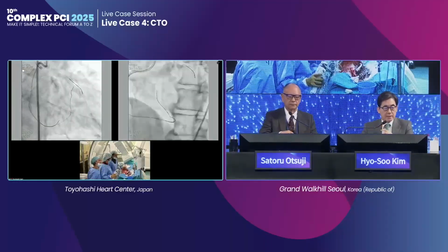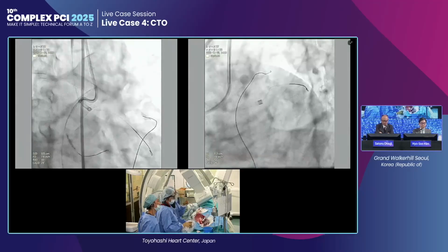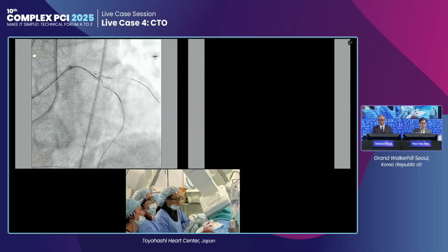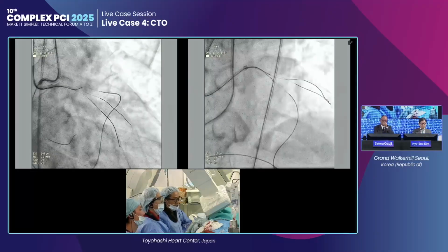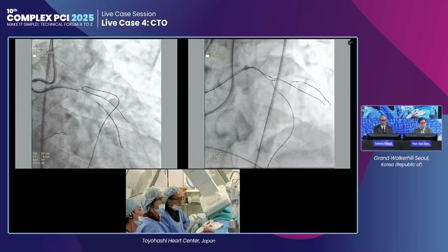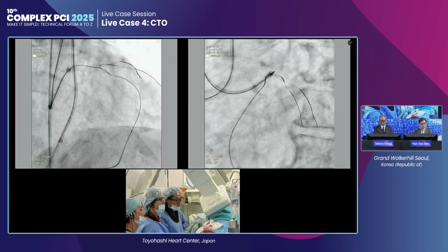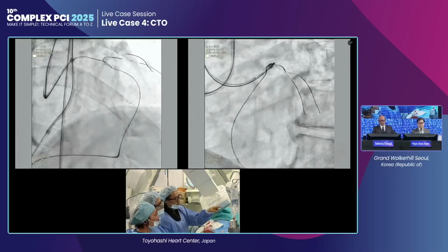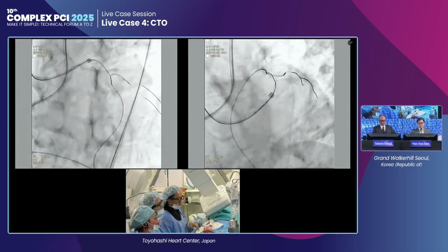After that, we negotiated the guide wire for the retrograde, which is a marker. Antegrade, I stepped up to the Gaia Next 4. Gaia Next 4 advanced to the previous one. Yes, this completely looks overlapped. We rotate it.